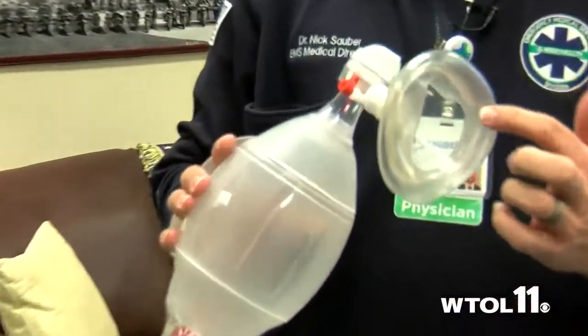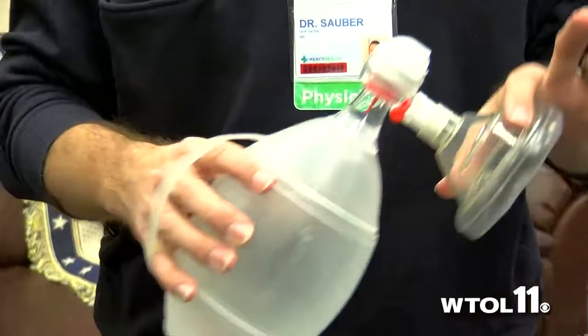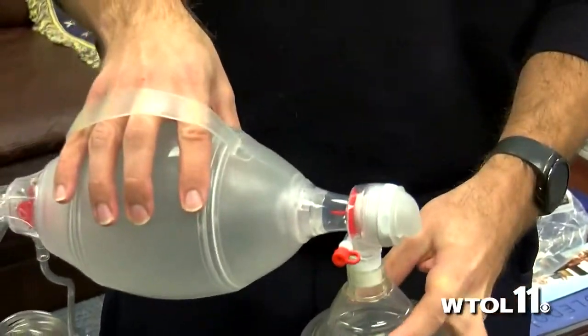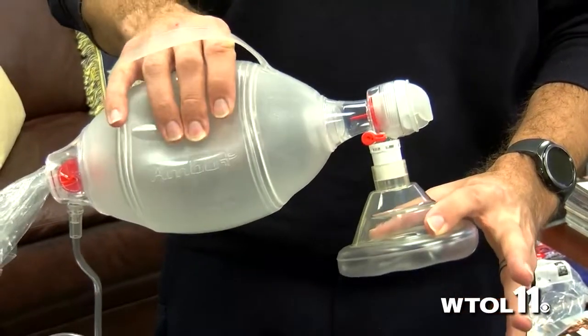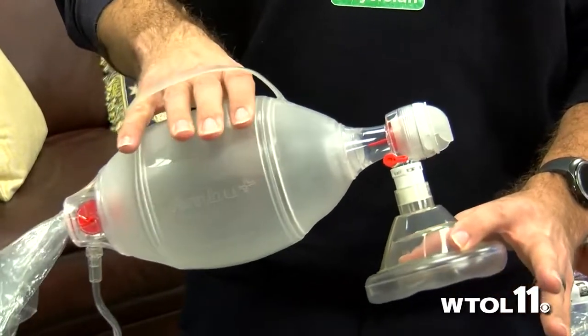This mask has a little cutout for the nose and then the mouth. It fits right over the mouth and nose like that. As you pull — we call it a C-and-E technique — the E fingers go into the jaw and pull the jaw up into the mask. This makes a nice airtight seal.